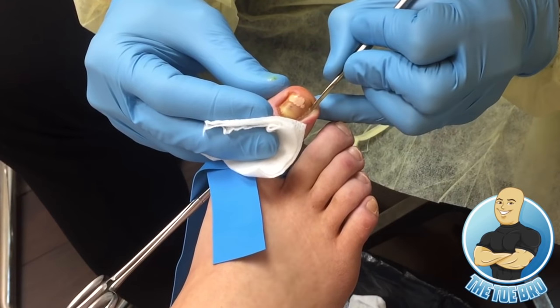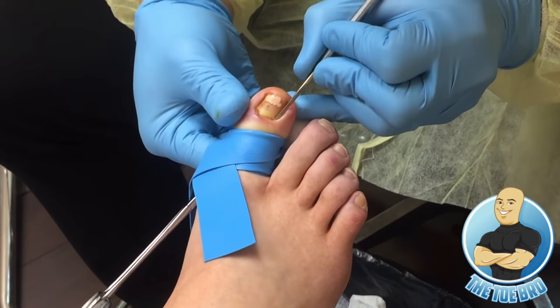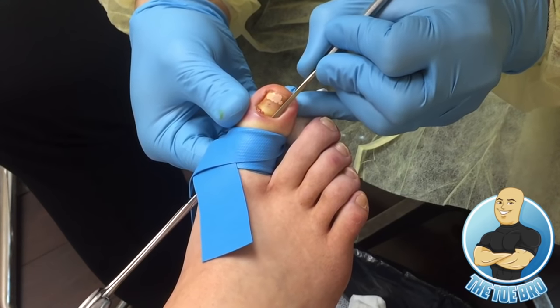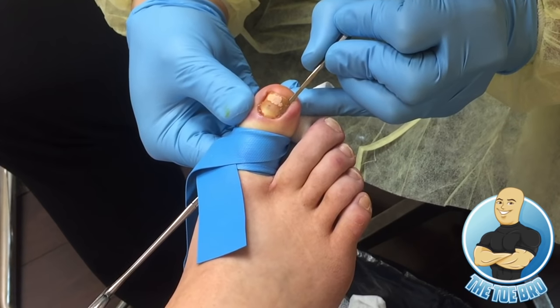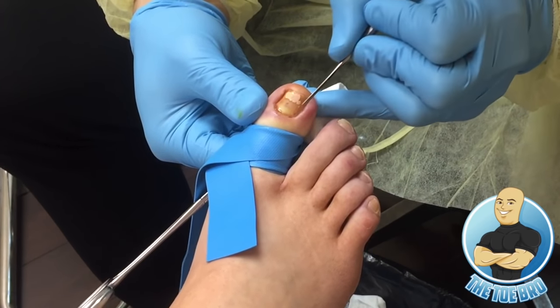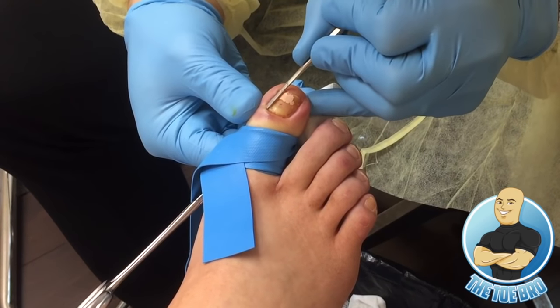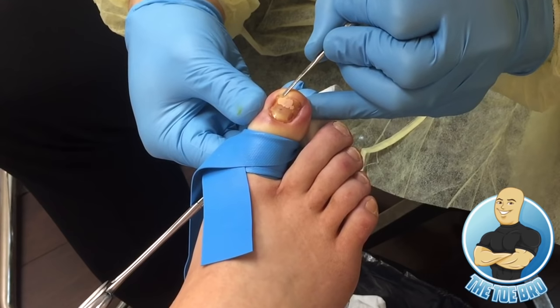So what I'm using is a nail elevator to gently separate the nail from the nail bed. At this point, if they're completely numb, there should be no pain at all. Slight pressure is normal, but no pain. So once I know they're completely numb, I will continue to separate the portion of the nail that's ingrown away from the nail bed and from the cuticle.